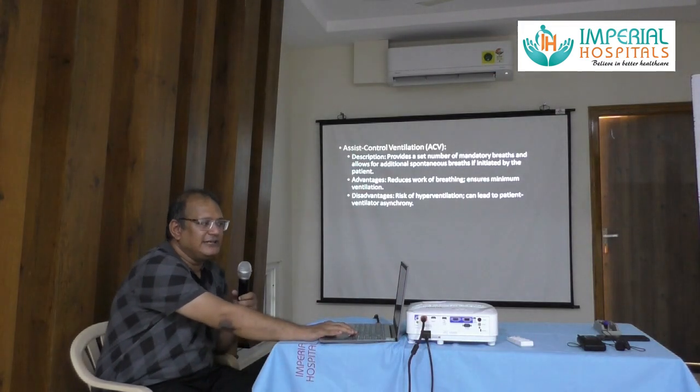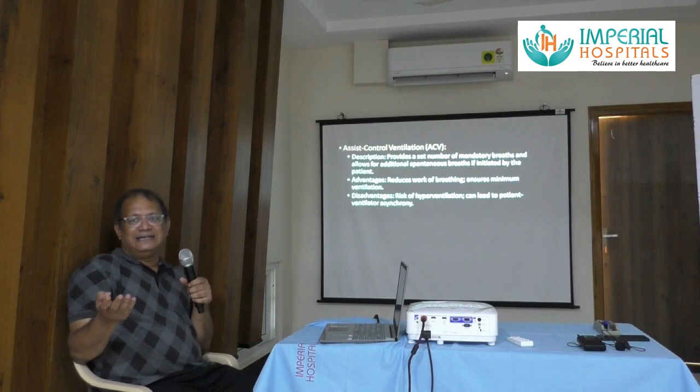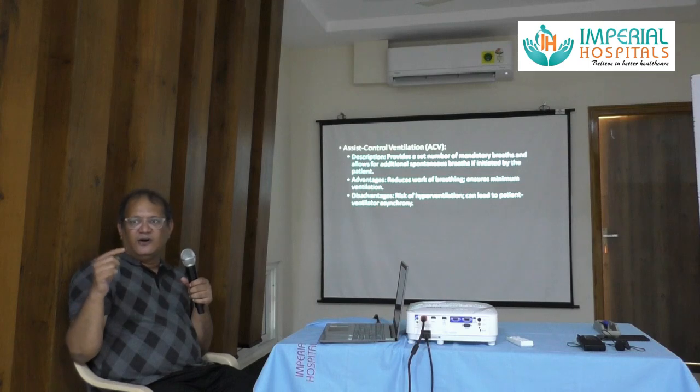So it provides a set number of mandatory breaths that allows for additional spontaneous breaths if initiated by the patient. How the ventilator will detect if the patient is initiating the breath is, it could be either pressure changes or it could be flow changes.